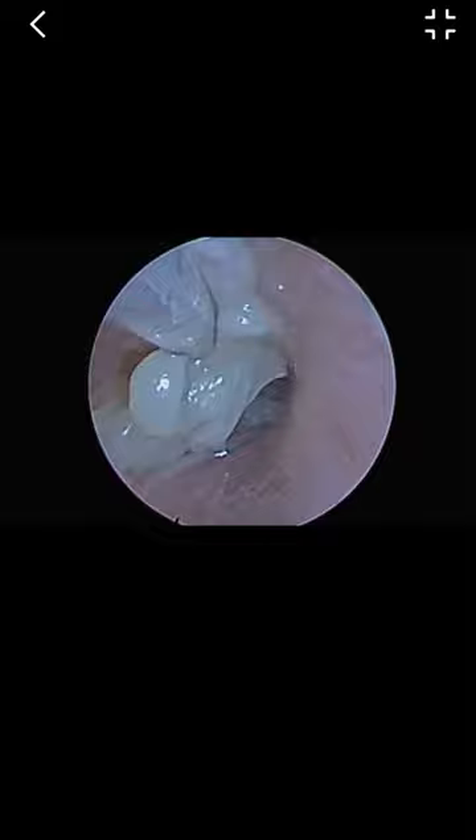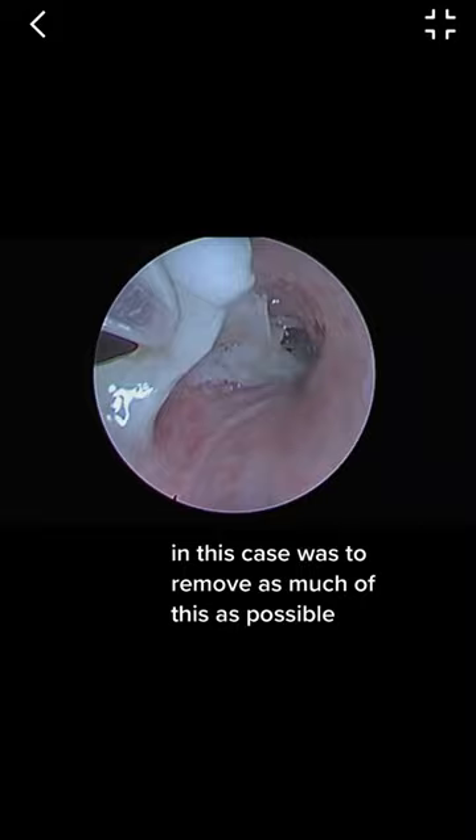The goal of this procedure in this case was to remove as much of this as possible — to get as clear of an airway as we could so that the patient is able to ventilate better. And this is the final picture.